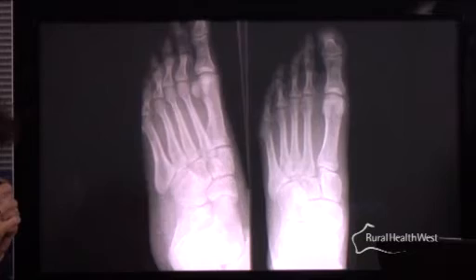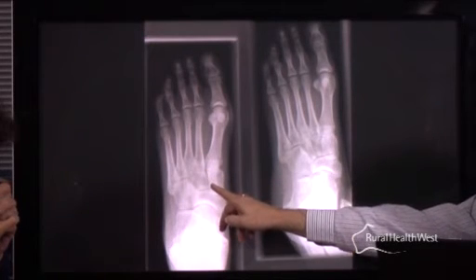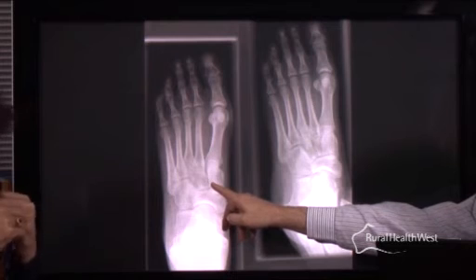I think it's a difficult clinical diagnosis often to make, and it's a difficult radiologic diagnosis, and they're often missed. So if we wrote suspect Lisfranc injury, then your alarm bells go off as well. Yes, and I think if you suspect there is a Lisfranc type injury, you would start with plain films, but you would probably move down to CT or MRI fairly quickly. And so often what you find, this is fairly normal, so when you look at the alignment at the base of the second metatarsal, it lines normally with the middle cuneiform.